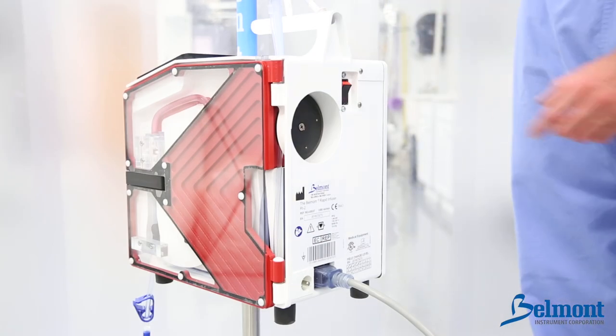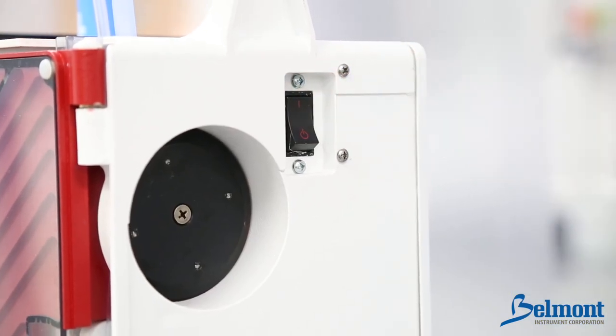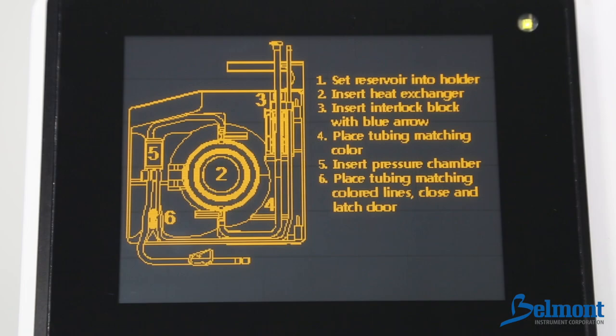You are ready to power on the system. Press the power button firmly to the on position, which is located on the back of the device. After a brief self test, operation instructions will be displayed on the screen.